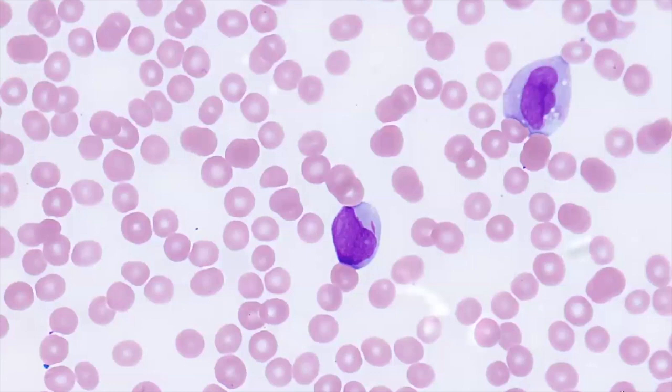So in this case, with greater than 20% blasts and inclusions of Auer rods, we can definitively call this an acute myeloid leukemia. However, we will also want to better characterize this blast population based upon immunophenotyping, cytogenetic findings, molecular techniques, and or special cytochemical and immunohistochemical stains. Acute myeloid leukemia is classified into 4 groups: acute myeloid leukemia with recurrent genetic abnormalities, acute myeloid leukemia with multilineage dysplasia, acute myeloid leukemia that is therapy-related, and acute myeloid leukemia not otherwise categorized.